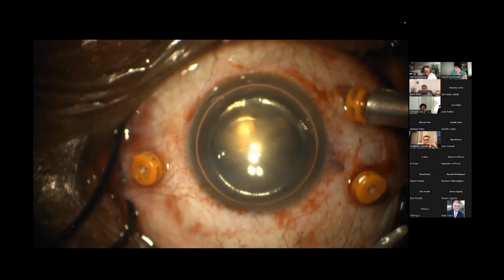But if the lens is a little bit tilted, if you think there is no lysis, just leave this lens, deal with this later. If you have a good view to complete the surgery, don't touch the lens. This is my point, because it will make this retina surgery much more complicated, especially if you're not prepared for it. Yeah, definitely. Unless you have no view, I think there's no point in taking it.